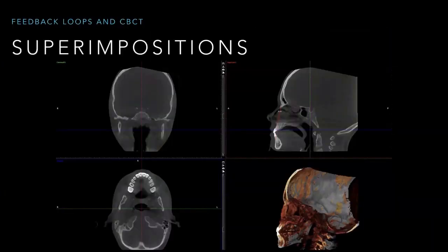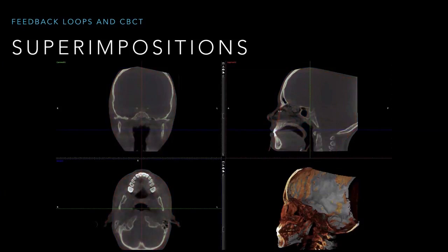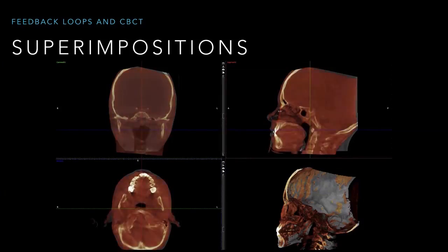Here's a short little video showing just how easy it is to do that. You superimpose over anterior cranial base, and then you just look at the treatment, and you can see what you did in all 3 planes of space. Pretty cool technology.